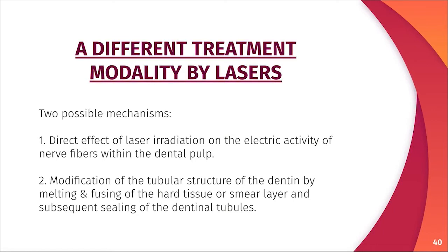The treatment modality by laser in the treatment of hypersensitivity is by 2 mechanisms. The first one, the direct effect of laser irradiation on the electric activity of nerve fibers within the dental pulp, and the second one is by the modification of tubular structure of dentin by melting and fusing of hard tissue or smear layer and subsequent sealing of dentinal tubules.